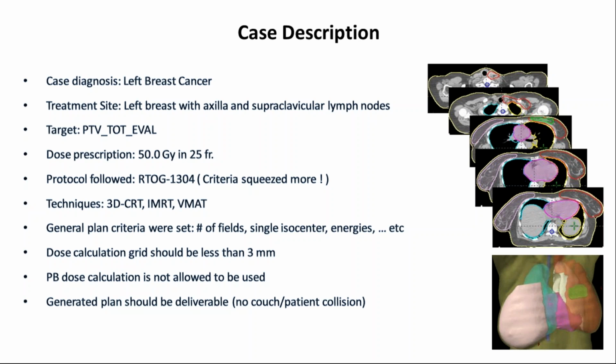The one who cannot achieve a high quality plan may say that it's a treatment planning system limitation. But when you see another planner from another side of the world achieve a high score using the same treatment planning system, this means that planners need to share their knowledge in order to improve. And this is what we are doing in this competition.